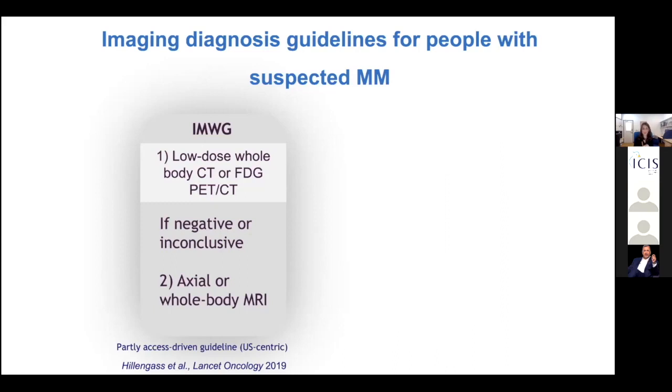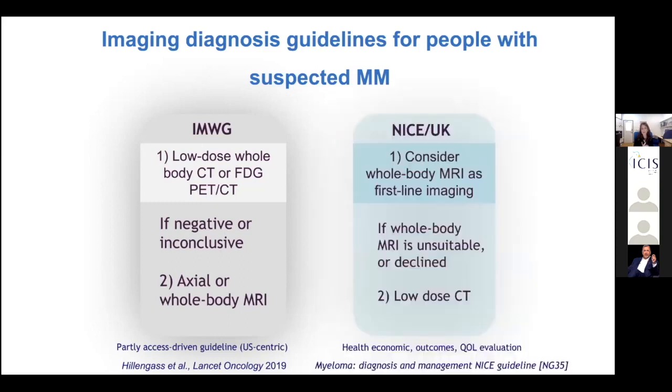Now, actually, in the UK, since 2016, our guidance has been slightly different. And the National Institute for Clinical Excellence has suggested that MRI should be first line. And I think they have been more ambitious for our patients and on behalf of our patients, because they have based that guidance on health economics, outcomes, and quality of life evaluation.